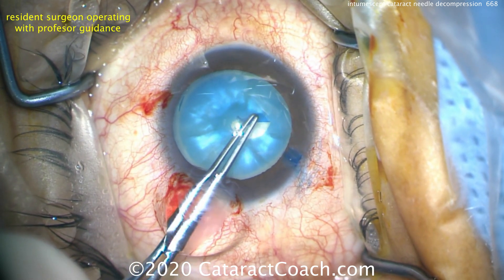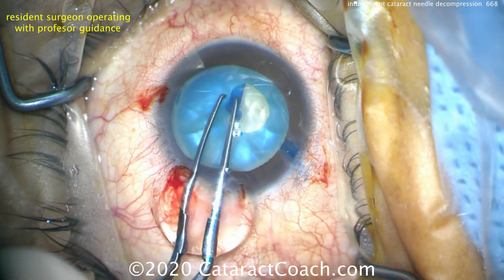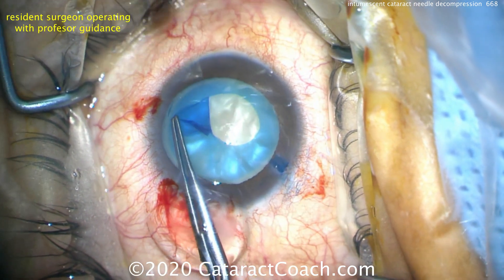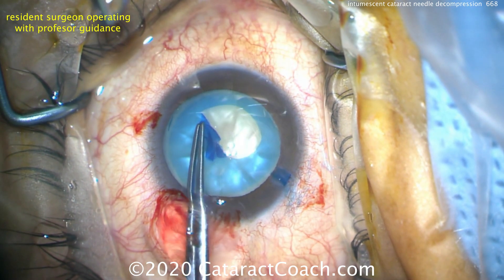That's because the capsular bag has been decompressed. The danger of the Argentinian flag sign is when the pressure within the capsular bag is higher than the pressure in the anterior chamber. When you start to create a capsulorhexis in that scenario, almost certainly the rhexis edge will run out and you're going to run into some trouble.